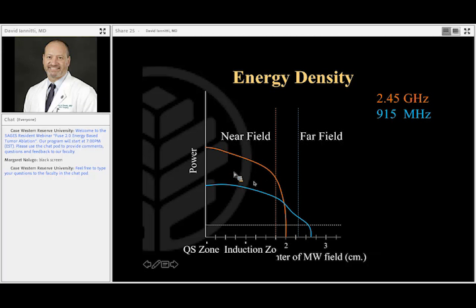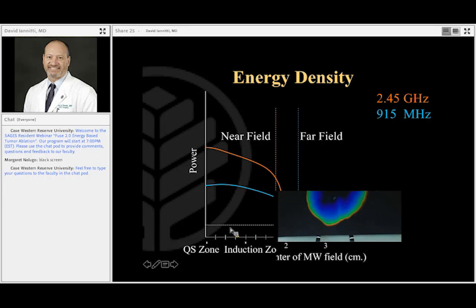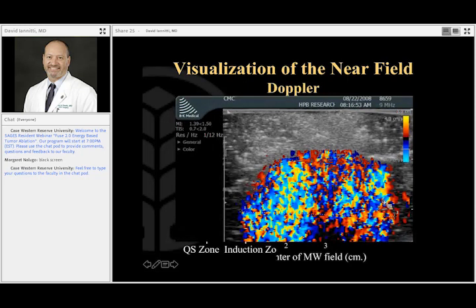And so this is called the microwave near field, and this is called the microwave far field. And this is also clinically important to know. And again, this is all the stuff we do in our lab. We develop and test all of these things, and this is just heat-sensitive paper, so you can see an even energy distribution, and then the energy falls off. And the cool thing is that for that microwave near field, we figured out that you can actually visualize it in real time with power Doppler on your ultrasound settings. And usually the scale, this is 4 because this is ex vivo, but your scale of your power Doppler is usually 8 centimeters per second.